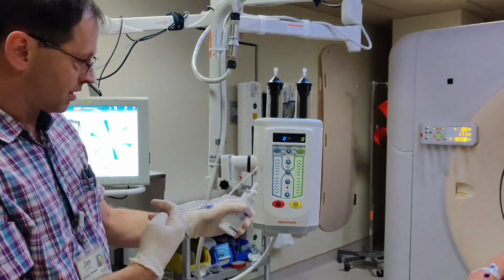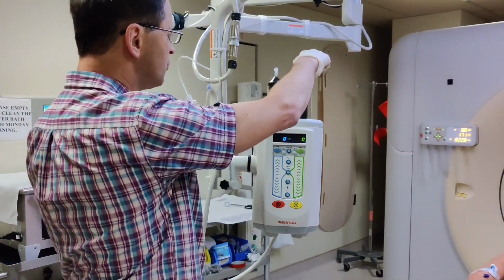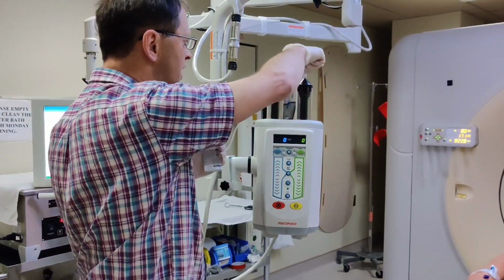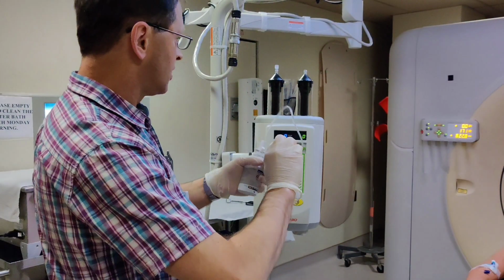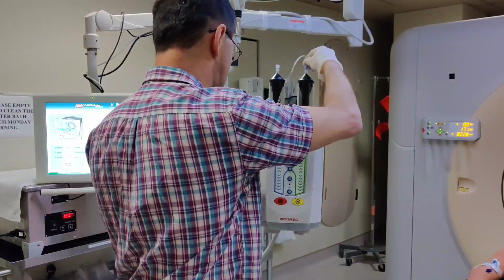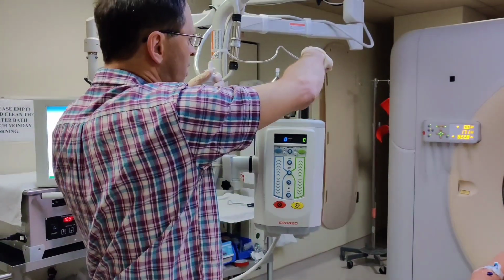So at this point, again, we're going to now remove the cap. So I'm going to load on the green side. The green side is, of course, for the contrast. Take off, being careful not to contaminate that tip. And I'm going to take the end here and attach that. Usually it's just a twist, a clockwise twist.